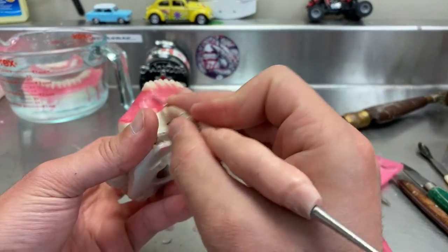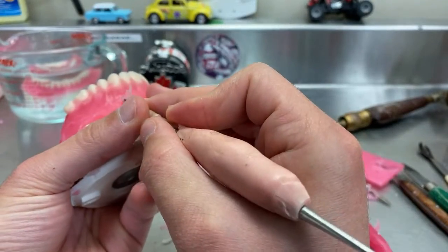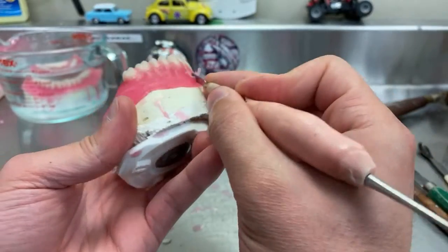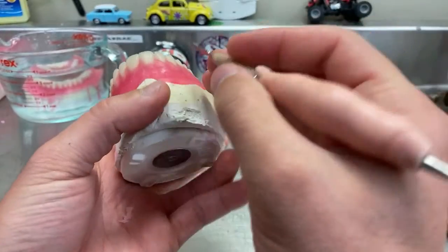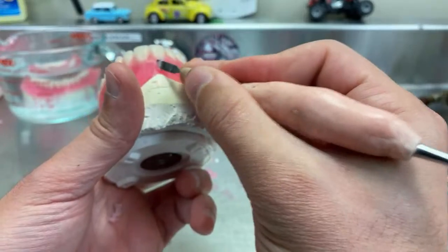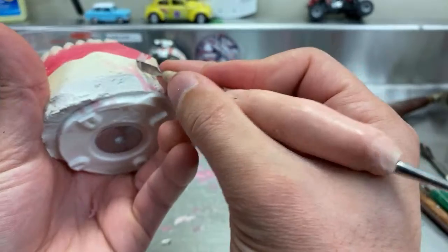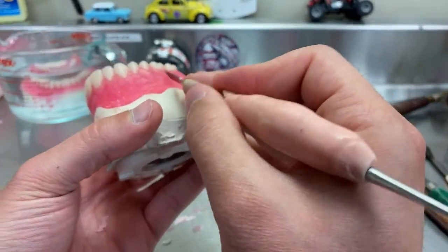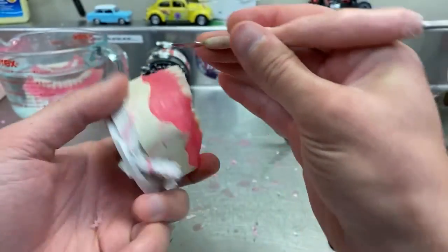So I'll start working and try to explain, because there's really not much to explain here. But if you see something, ask me if you're wondering why I'm doing it. Right now I'm just shaping that base plate to make it look nice and presentable. Because I mentioned before that if you want to attract more business, more dentists to your lab, you need your work to stand out and be different and clean.